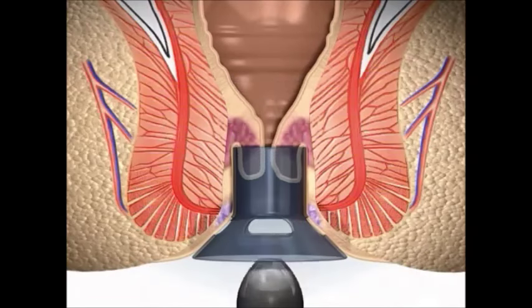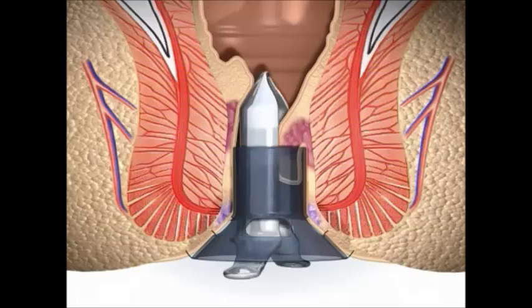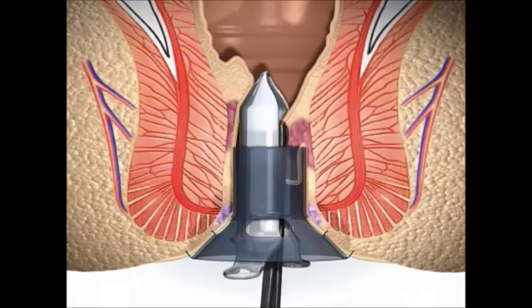A proctoscope is then inserted which allows for a purse-string suture to be placed two centimetres above the dentate line. This is an area that is insensate — there are no nerves.